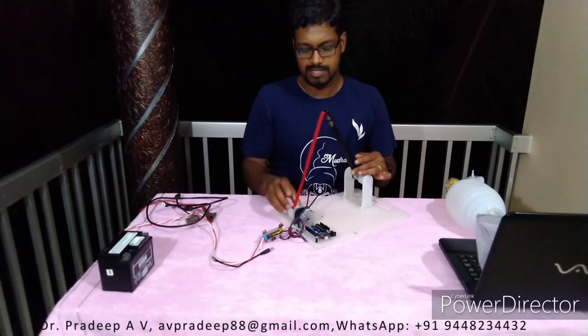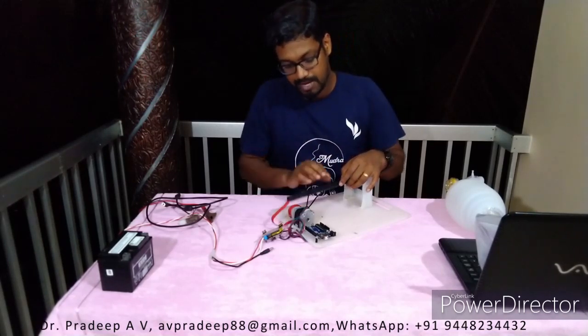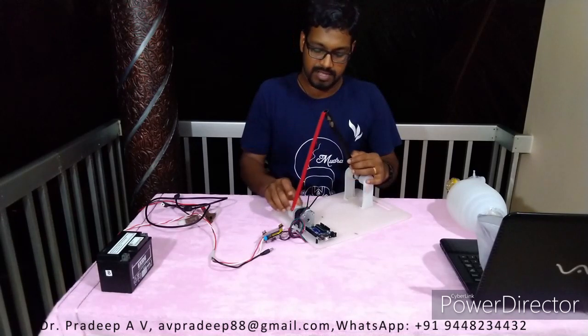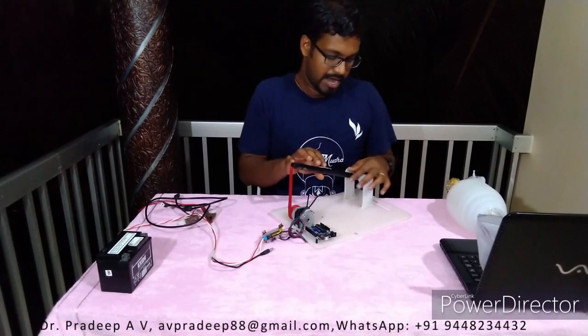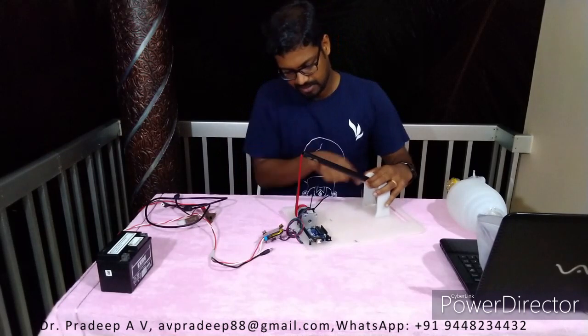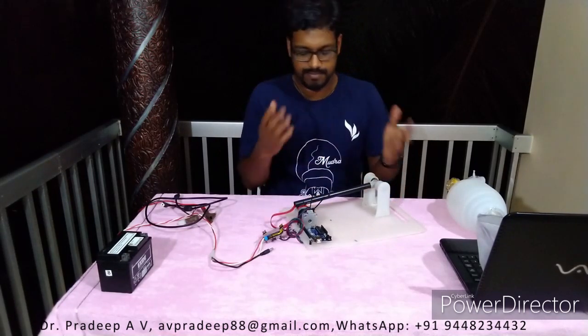At the moment, what it does is the stepper motor rotates and presses the AMBU bag. The AMBU bag is supposed to sit here, and then it releases. This is the protocol we are going to follow. For a better design, we need a slightly bent shaft, like this. That will be a better design. And if it can press from both sides, that will be better.